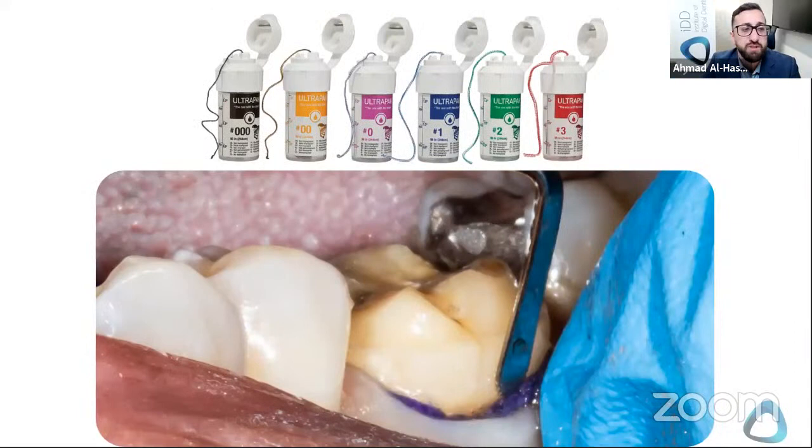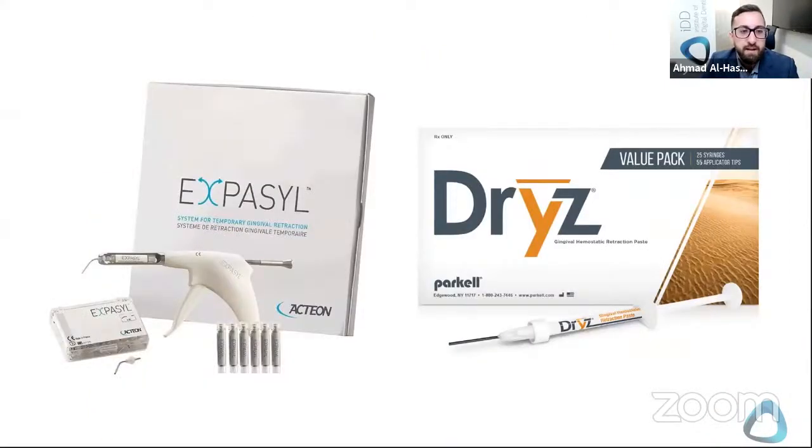So this is an example, just whatever retraction cord you use in the practice. I don't really find that there's anything special between retraction cords. Just get a number of sizes. Oftentimes dentists only have one size, and it's the smaller size because it's very easy to pack in there. Get a good size and then really pack it in there.